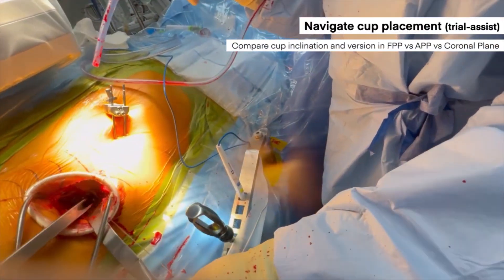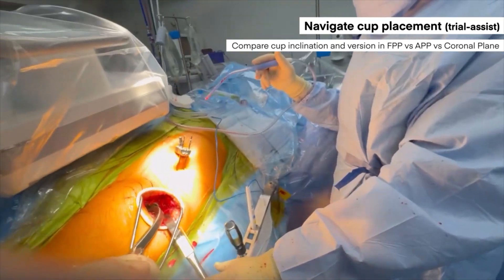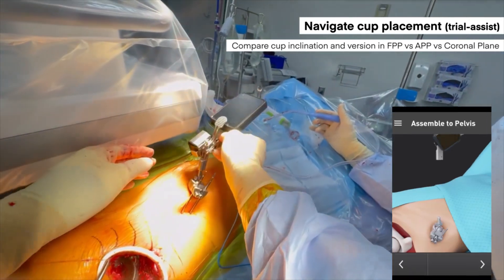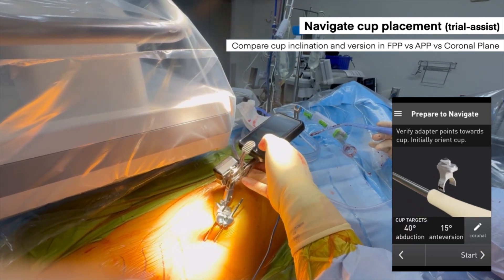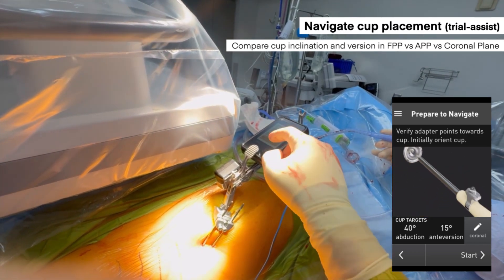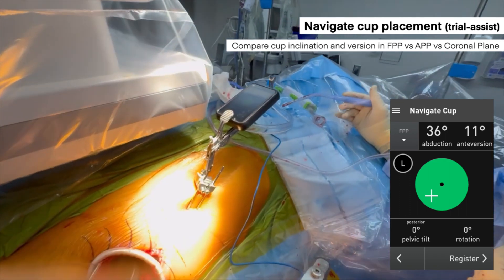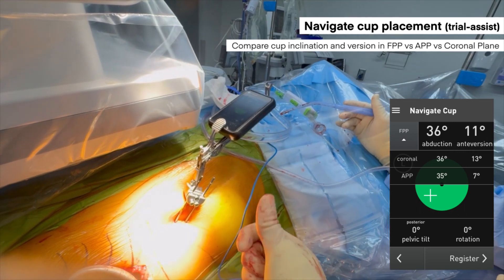We use the Lantern Hip system to navigate the final component positioning. I'm using my standard impactor handle, and there's an adapter you can place onto your handle so you don't need any specialized handle to navigate component placement. The Lantern Hip system uses the sensor to guide your impaction of the acetabular component. I like to do this in two steps: first, I get the impactor into the position I think it should go, then use the sensor to confirm or guide my impaction. Here, my abduction is at 36 degrees and anteversion at 11 degrees — I wanted slightly more anteversion.